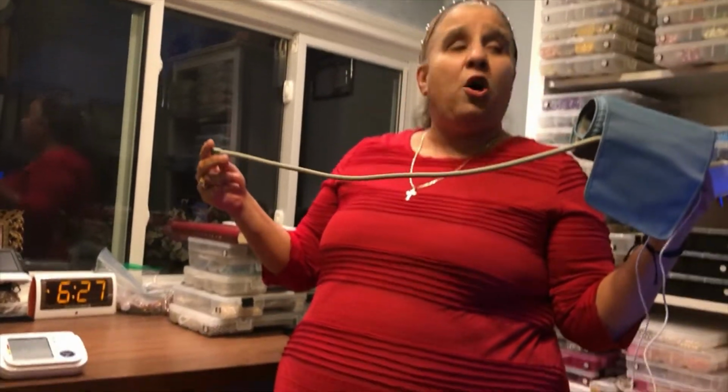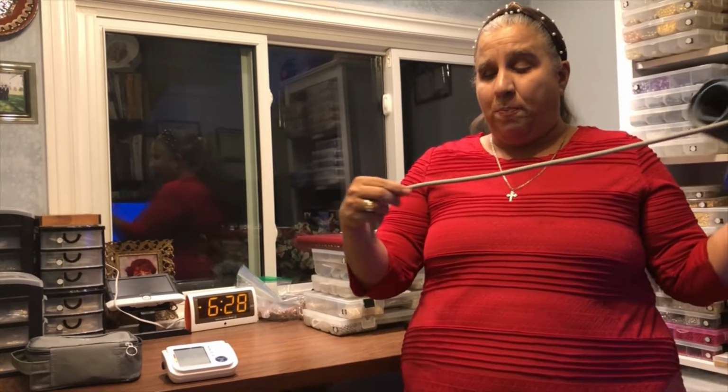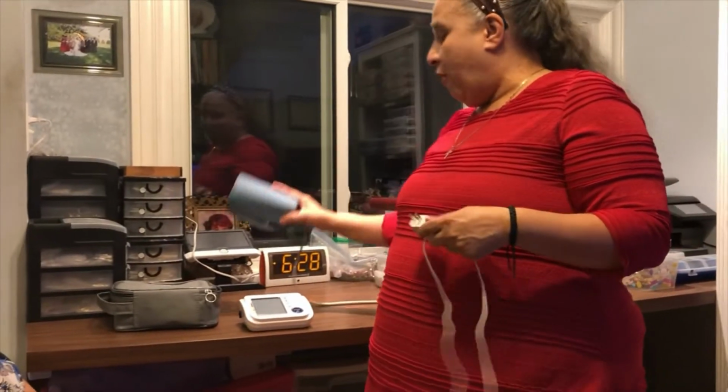You've all been to the doctor, so thank God. The fact that I'm not good at describing doesn't matter, because you've all had your blood pressure taken. So it's this Velcro-y thing that goes around your arm, and it's got a plastic long tube that hangs from it, okay? So now, this is a talking monitor.